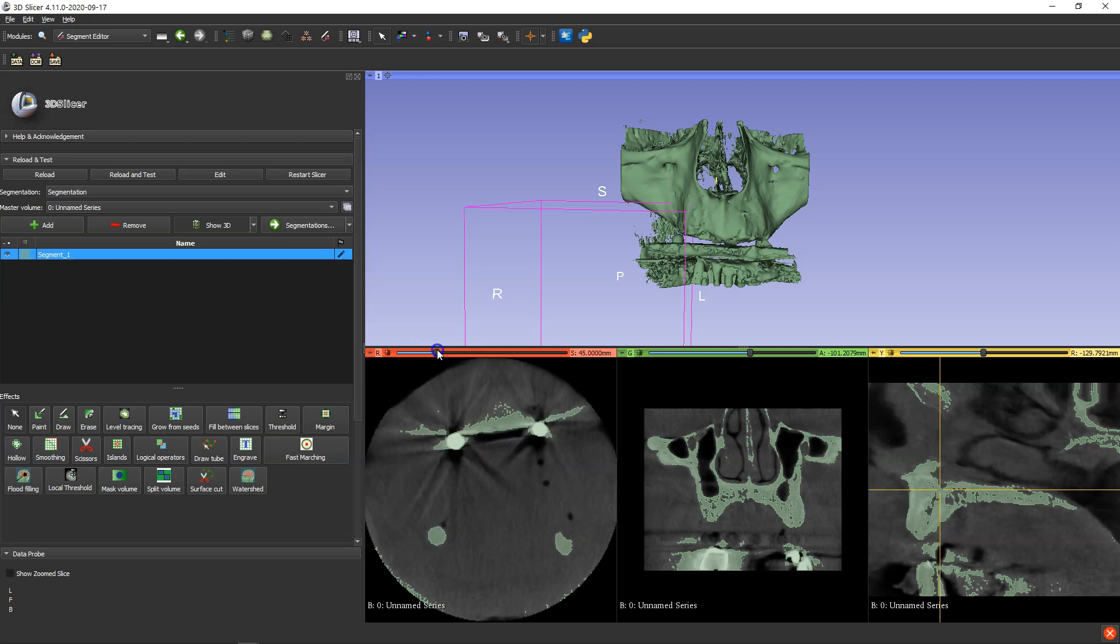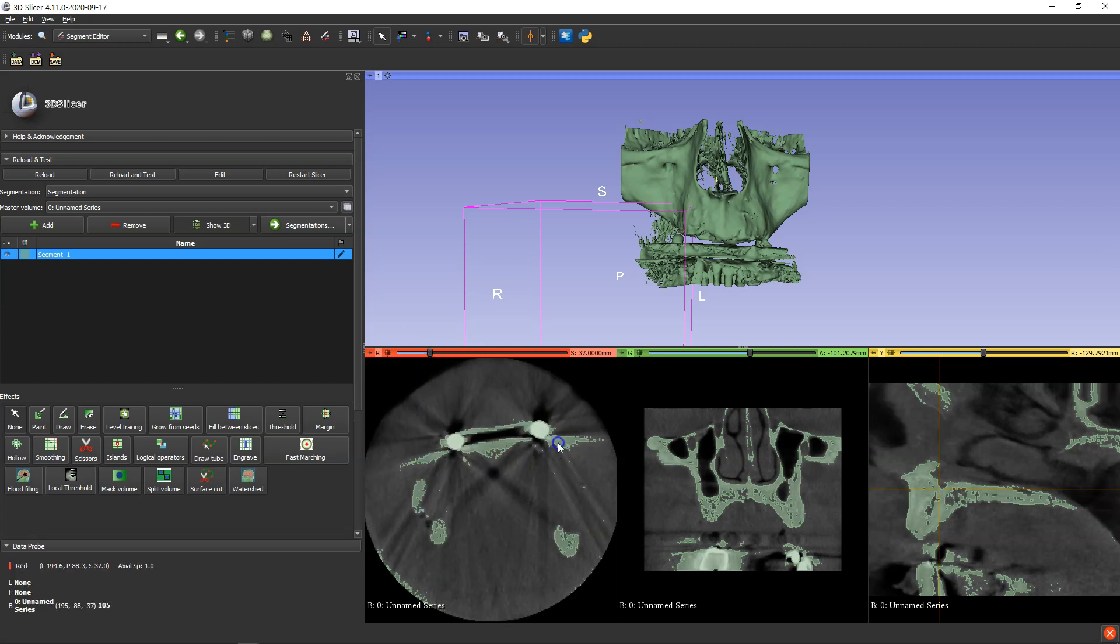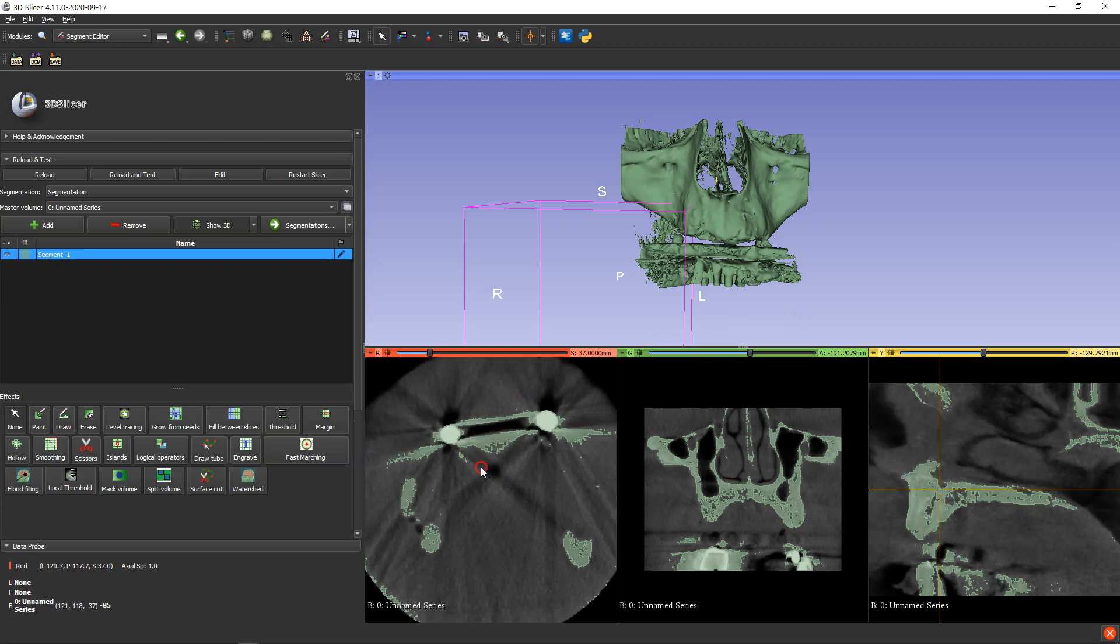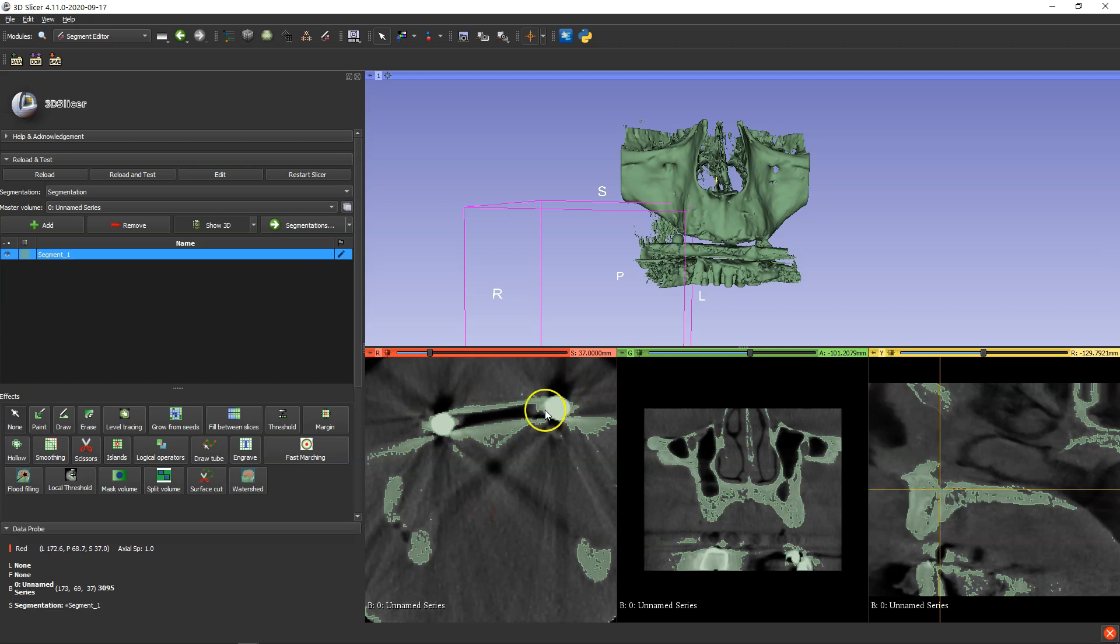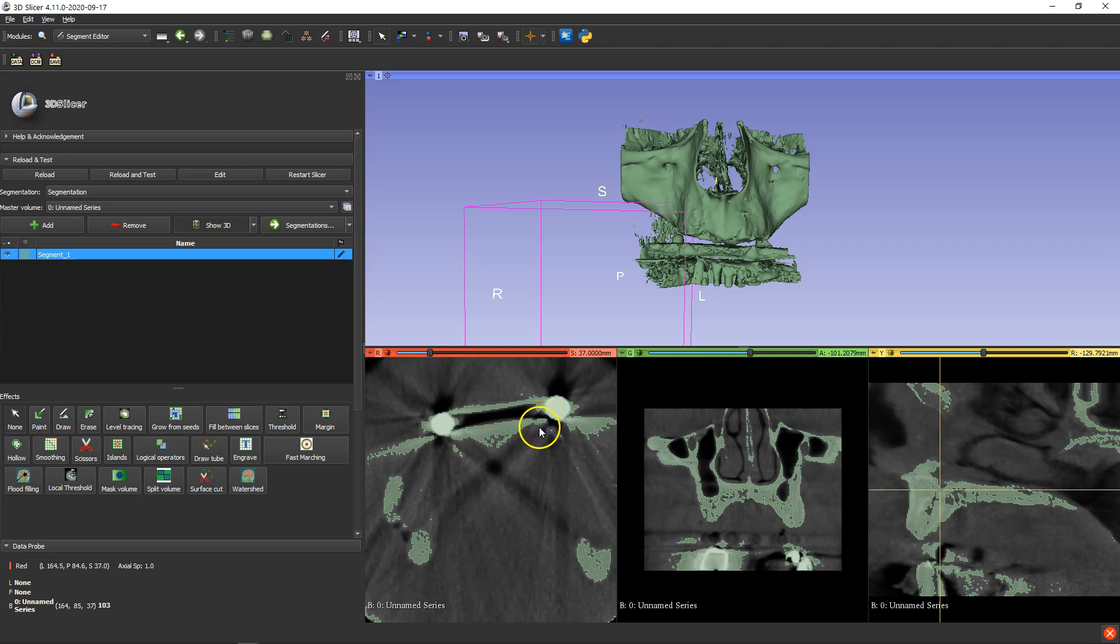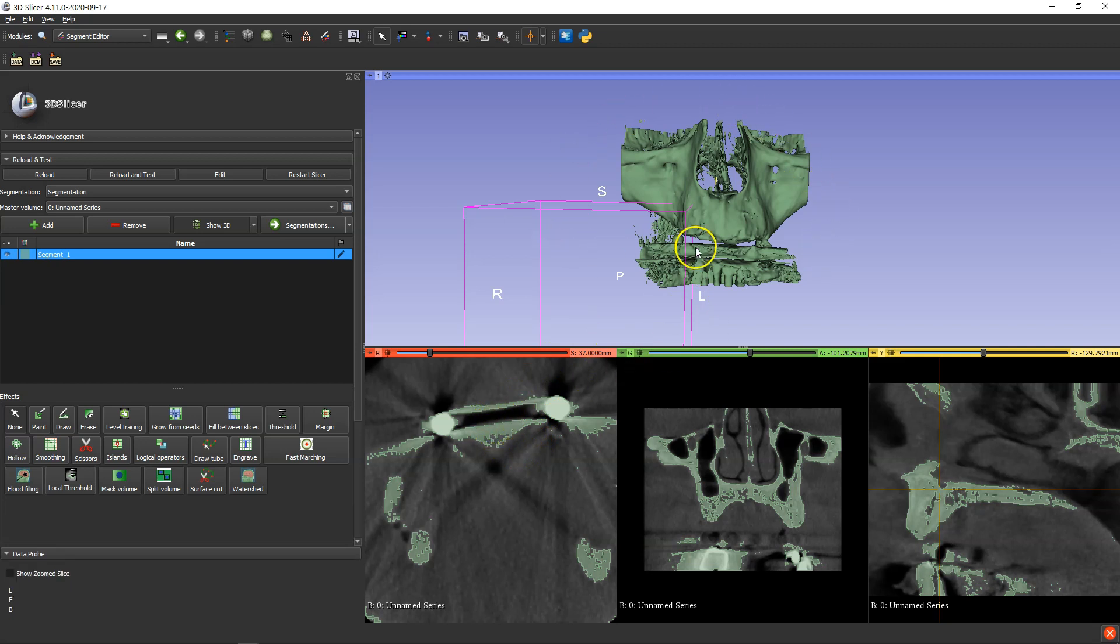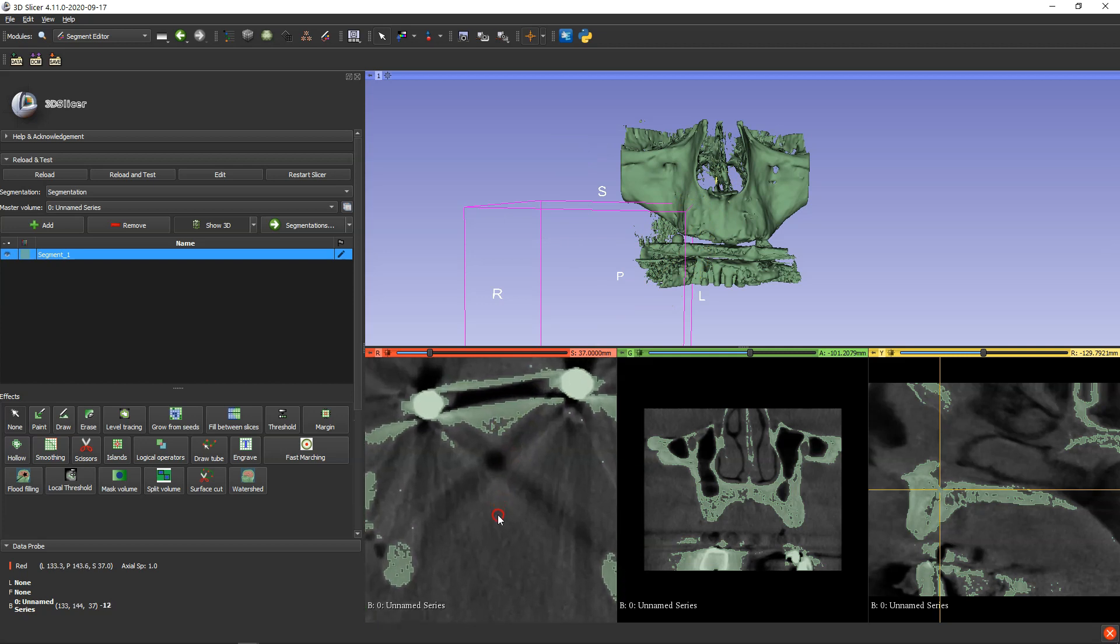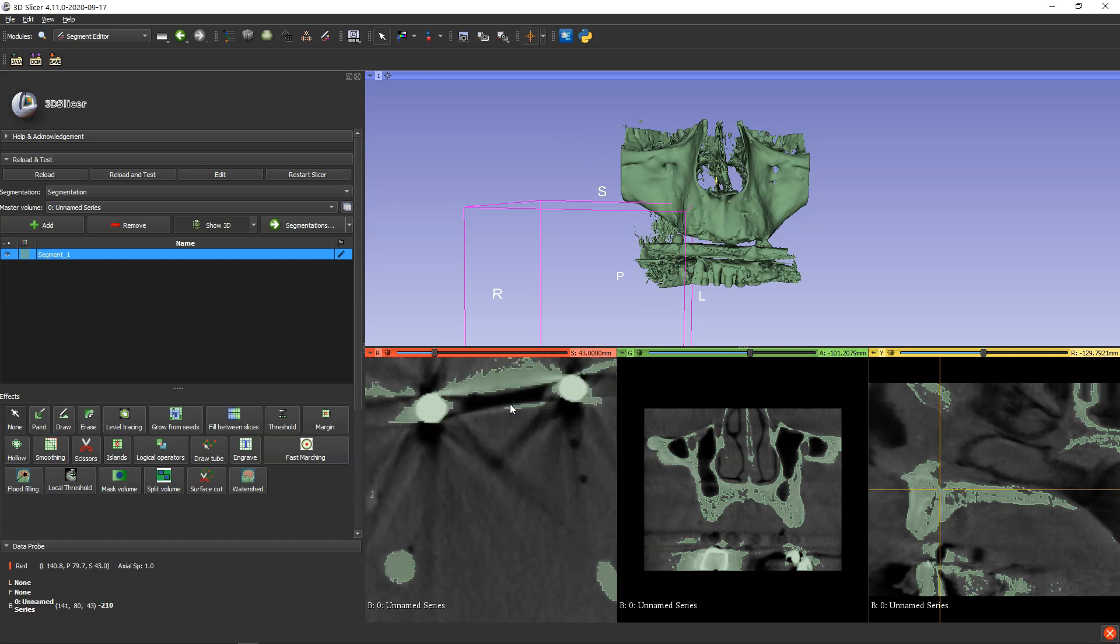I also noticed that there are two sphere-shaped items. Now we don't get to see this, but this is part and parcel of a denture in the patient's mouth. These little metal spheres or marbles have been placed inside the denture so that we can then align the denture to the CT scan section model later on to make an implant guide. Note however how much scatter is there.